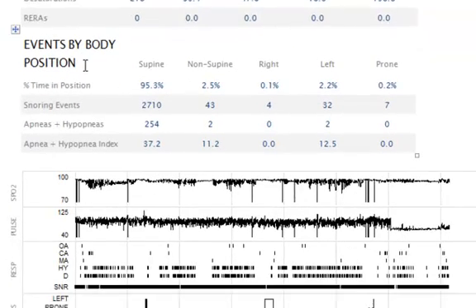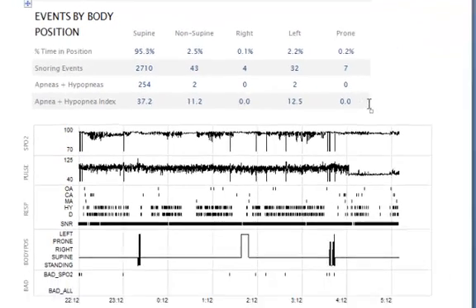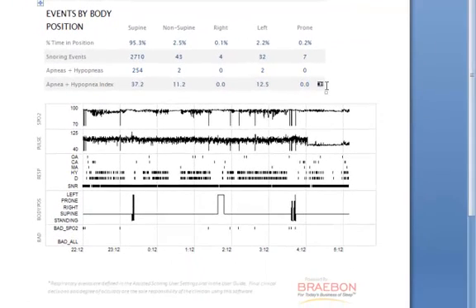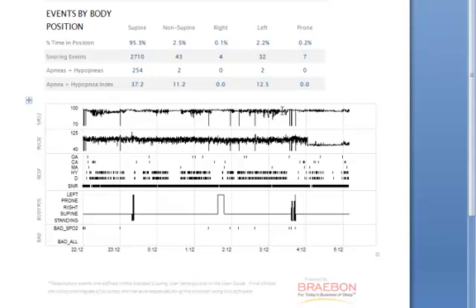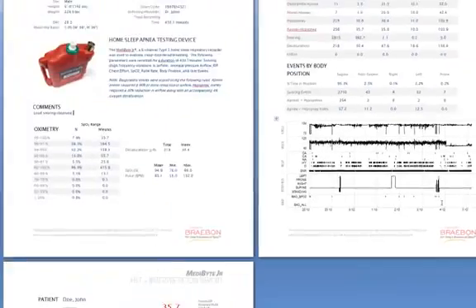The events by body position table is important because it then allows you to look at any positional apnea which occurs. Beneath that you have a breakdown of the total night graphs of SpO2, pulse rate. Each tick here shows obstructive apnea, central apnea, mixed apnea, hypopneas, desaturations and snoring. Then the body position. Each tick mark here shows you an SpO2 dropout which would be automatically detected by the software and marked as bad SpO2. Usually those are only a fraction of a second in duration or perhaps one or two seconds.